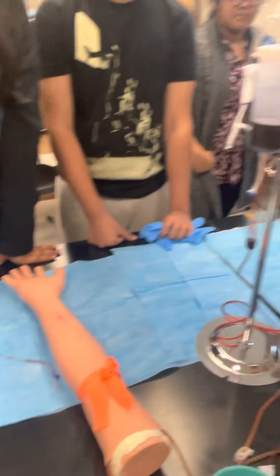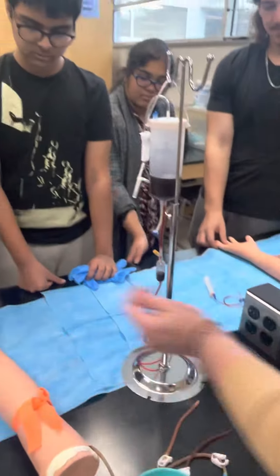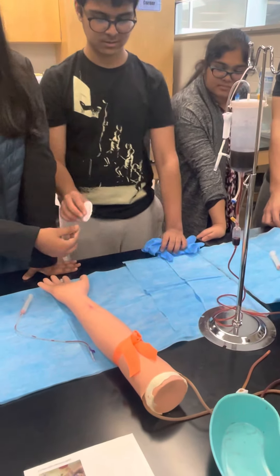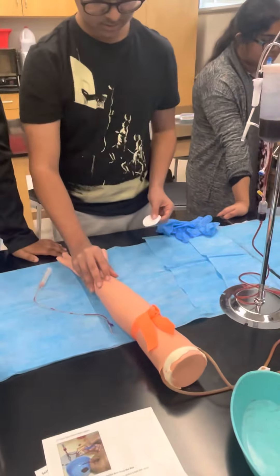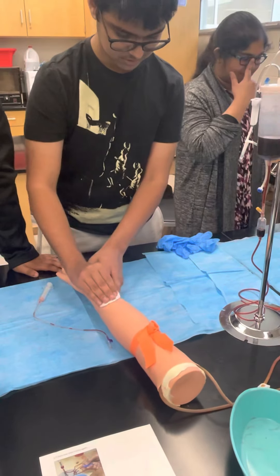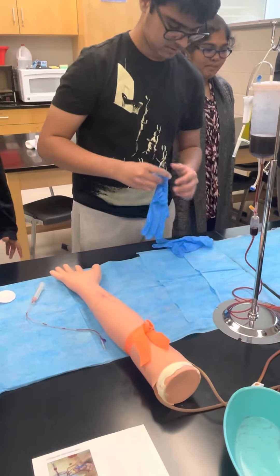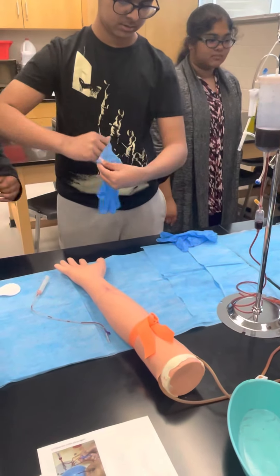We don't use real alcohol pads because alcohol breaks down the skin. Find out where you want to go, wipe it down, then put your gloves on. This is the fun part.